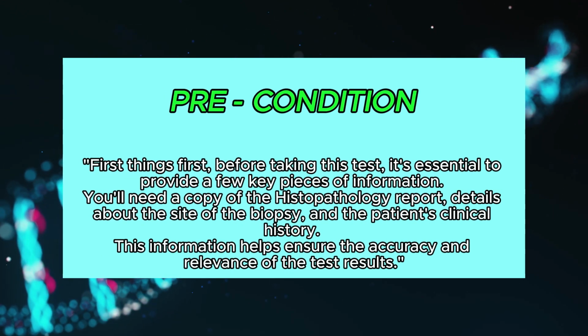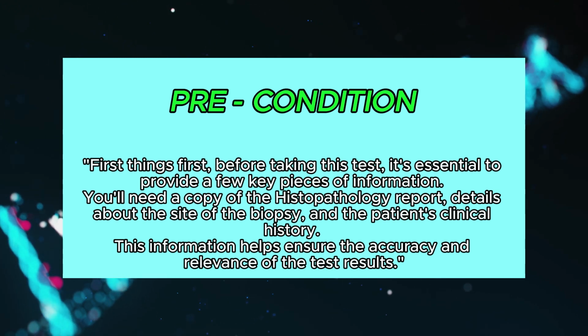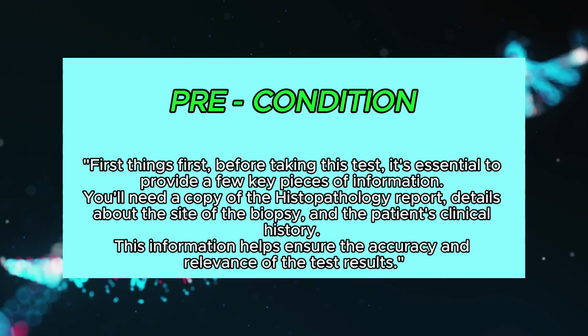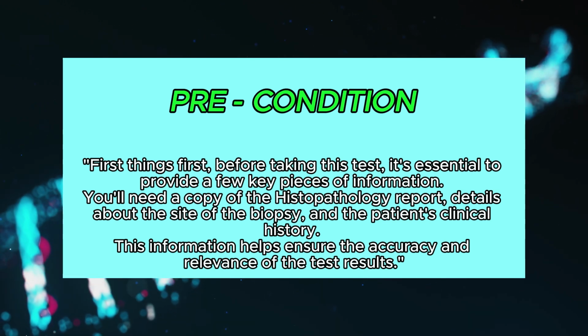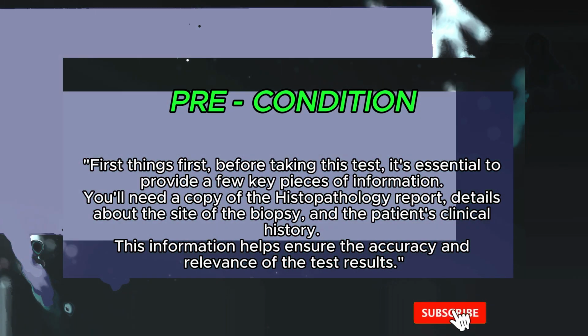First things first, before taking this test, it's essential to provide a few key pieces of information. You'll need a copy of the histopathology report, details about the site of the biopsy, and the patient's clinical history. This information helps ensure the accuracy and relevance of the test results.